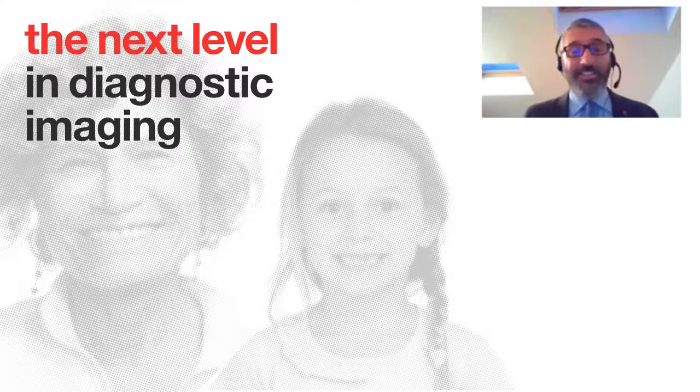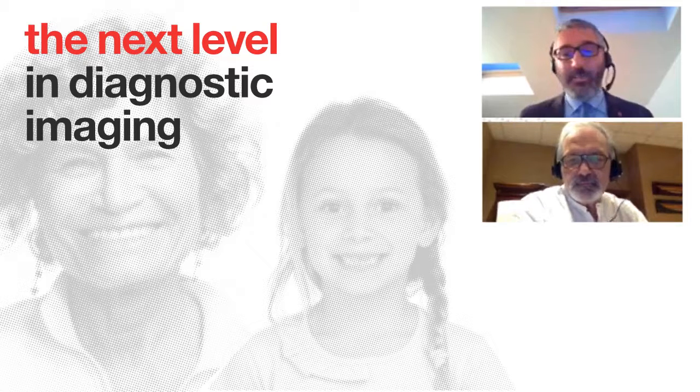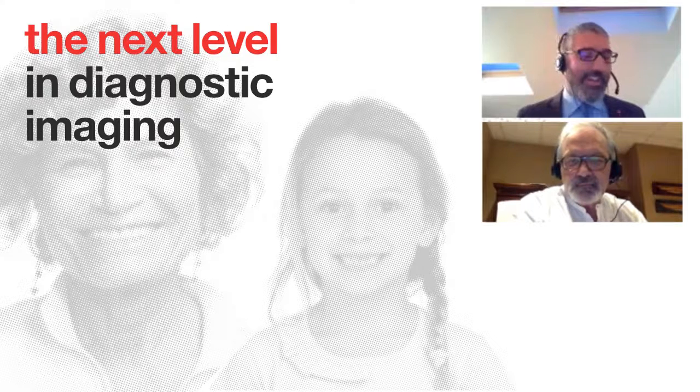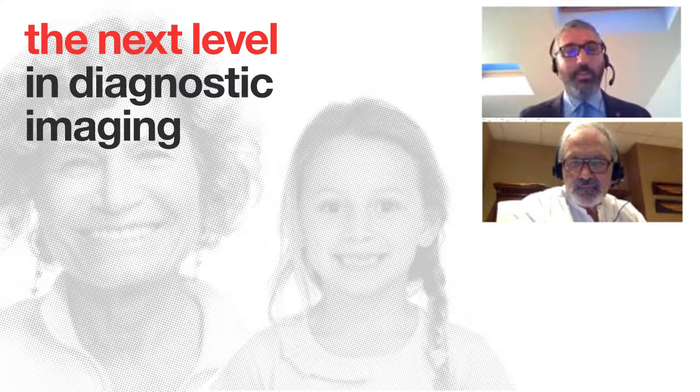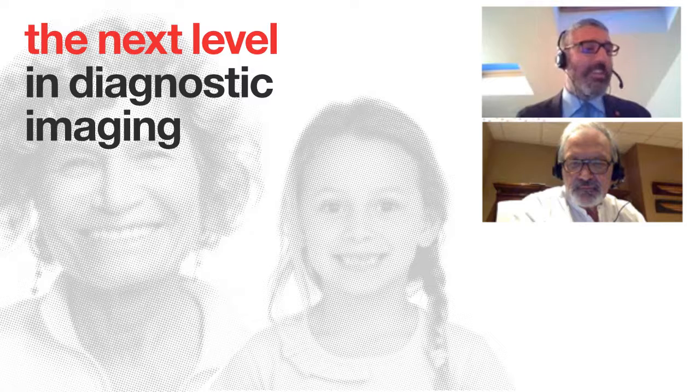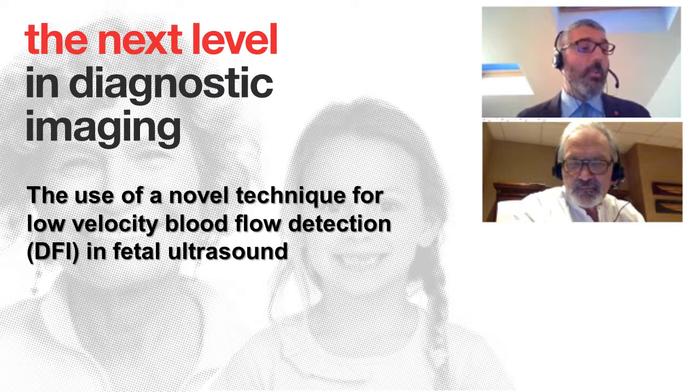And I'm very, very glad to have today Dr. Marc Althuser with us. He is the speaker of this webinar for today. He is a gynecologist working in Grenoble in France in fetal medicine. He's working in the hospital in Grenoble and also has his private practice. He will speak about one topic. The title of the lecture is the following: the use of the novel technologies for low velocity blood flow, DFI, in fetal ultrasound scanning.